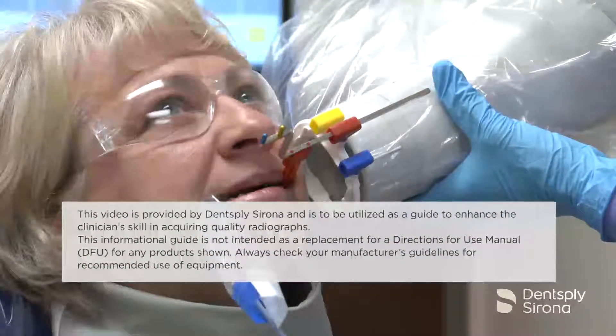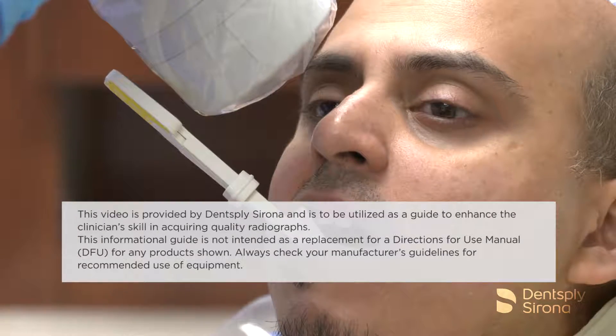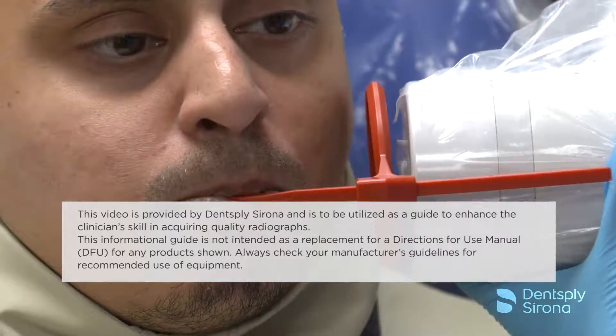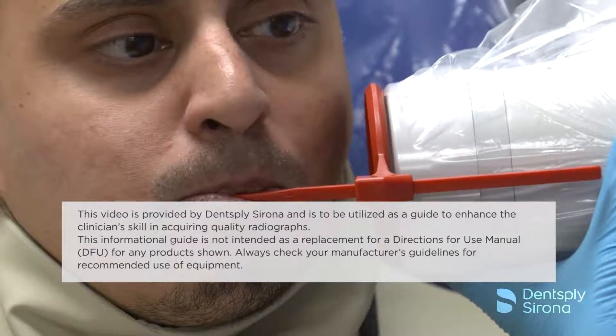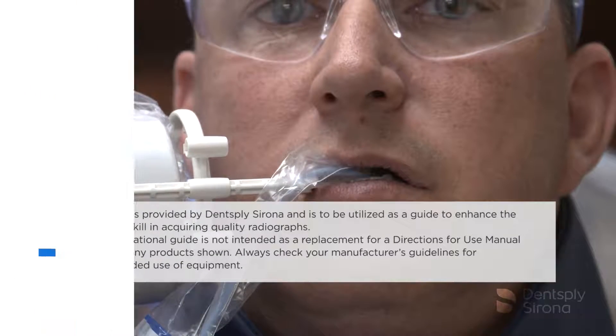This video is provided by Dentsply Sirona and is to be used as a guide to enhance the clinician's skill in acquiring quality radiographs. This informational guide is not intended as a replacement for the directions for use manual for any products shown. Always check your manufacturer's guidelines for recommended use of equipment.